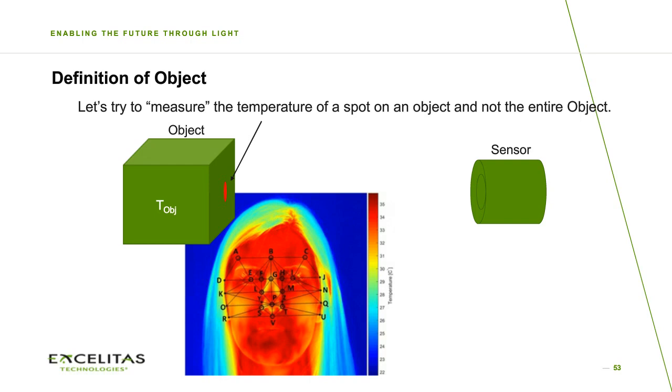Well, that has relevance to this next question. Is there any solution that can be implemented to create an FDA-approved fever screening at 1 meter? I am not aware of this one, but I might be wrong. So I'm very open if you provide me a solution doing this. Everything what I know is you identify those people who are sticking out of the crowd or are warmer than a black body, and those people you need to take out and then remeasure actually with a high accuracy device by penetrating the ear canal, for example.